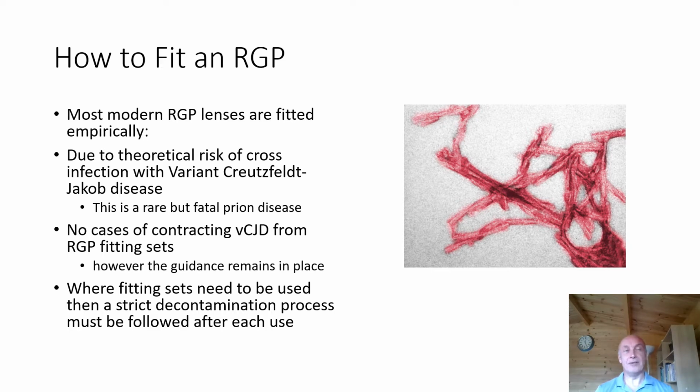There is an exception in some hospital practices where fitting set lenses are necessary because of the complex nature of the patients that we are seeing. However, there is a very strict and rigid decontamination process which must be used with all reused fitting set lenses. But as we say, for most patients that we're going to see in high street practice, empirically is the way forward.